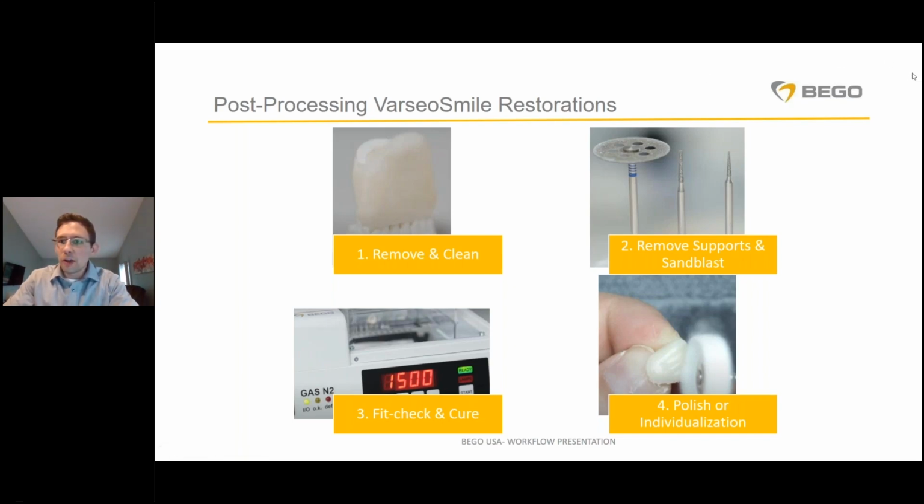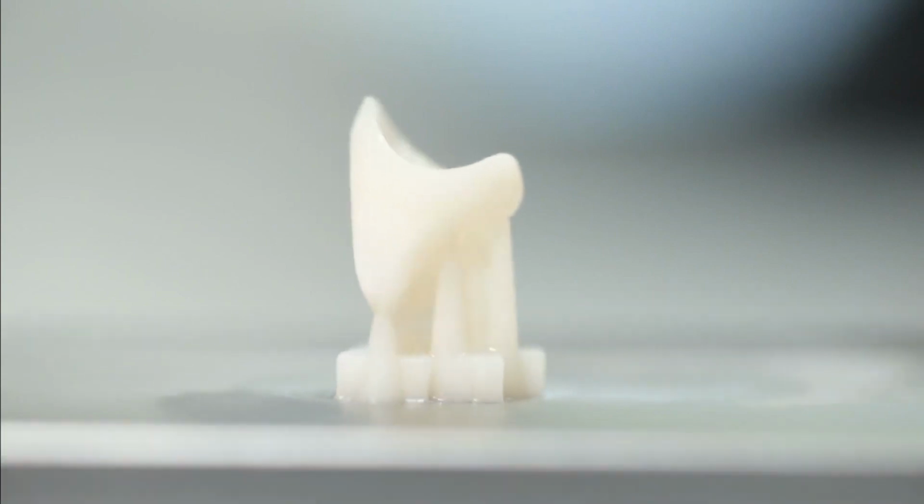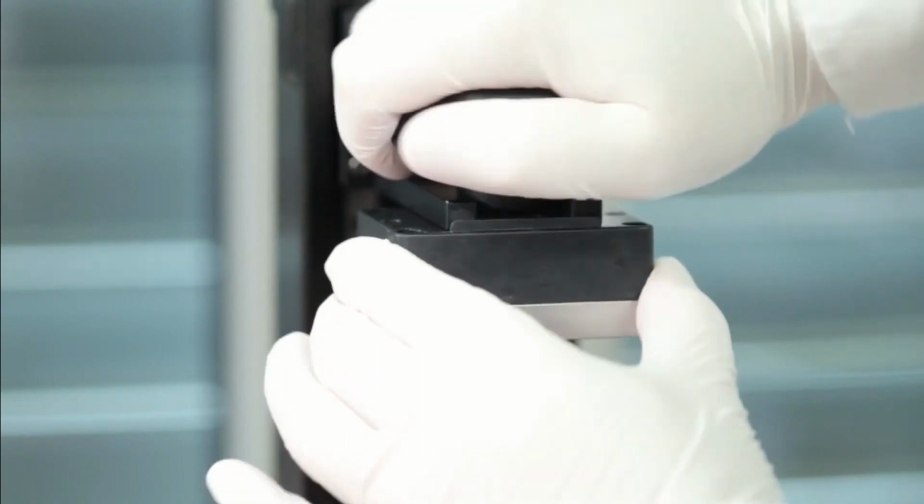So let's check out a video. So the object is removed. The build platform is wiped back down and reinstalled in the machine, and it's keyed. It can only go in one way.